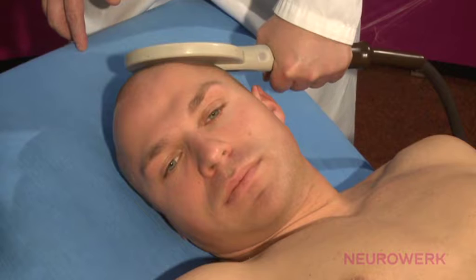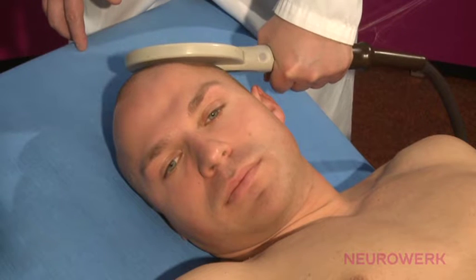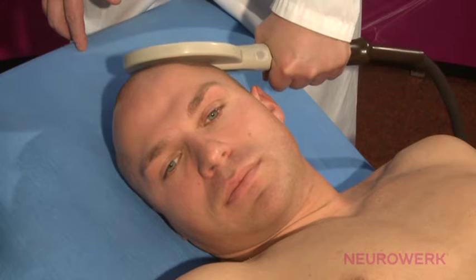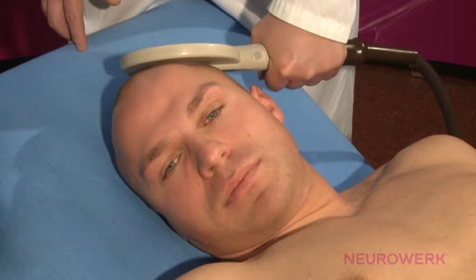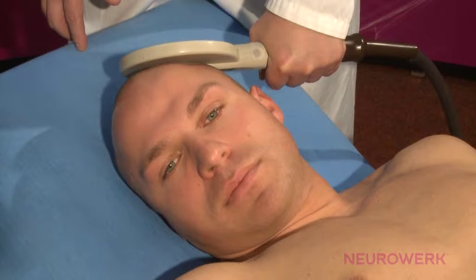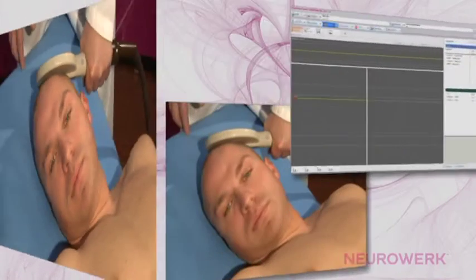At first, the cortical stimulation is performed. With the lowest stimulation intensity, we are searching for the area above the head where the highest MEP amplitude occurs. Thereby, the encircling coil is placed so that the center of the coil is located over the vertex, that is, over Cz. Here the field for the hand muscles is positioned.